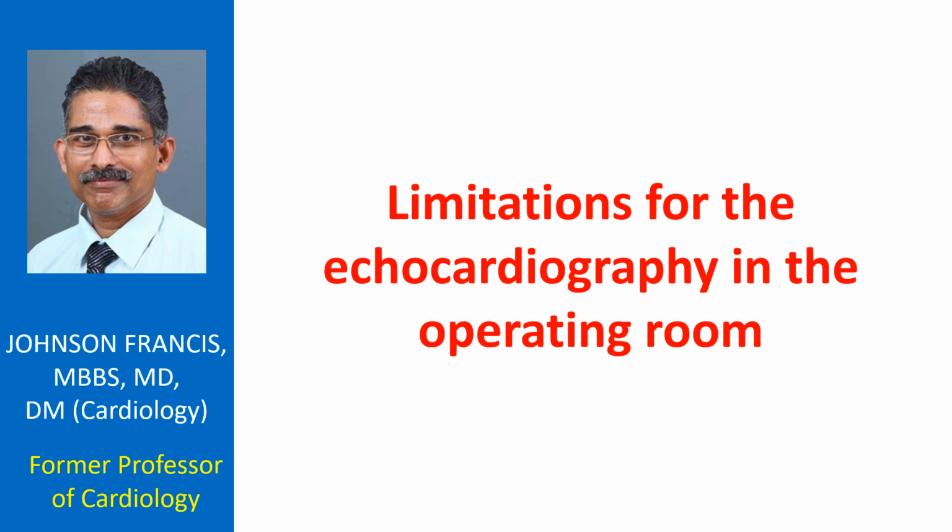Cardiopulmonary bypass can alter the afterload and hence the hemodynamics. Surgical manipulation can cause cardiac arrhythmias and interfere with interpretation of parameters like mitral regurgitation.